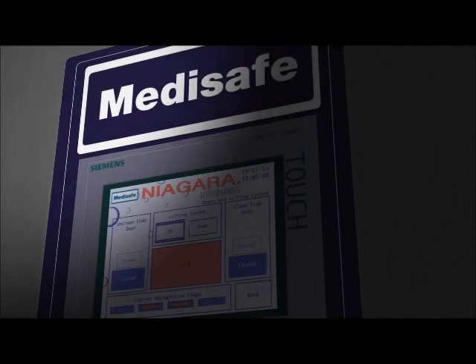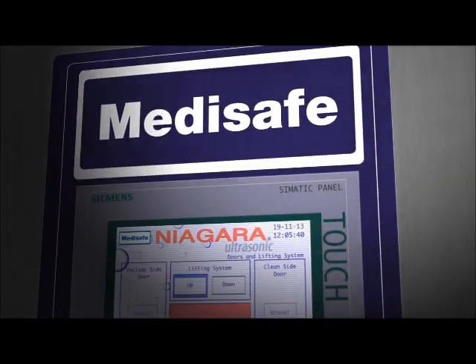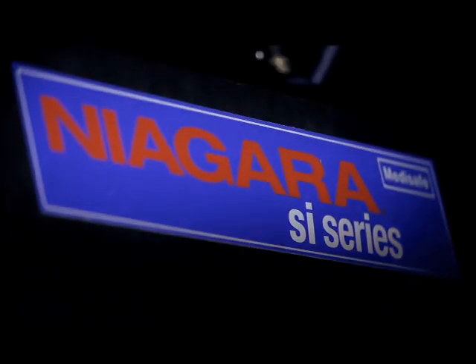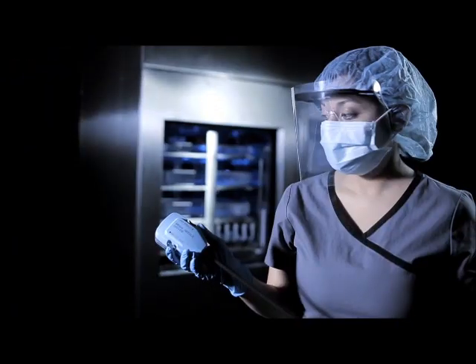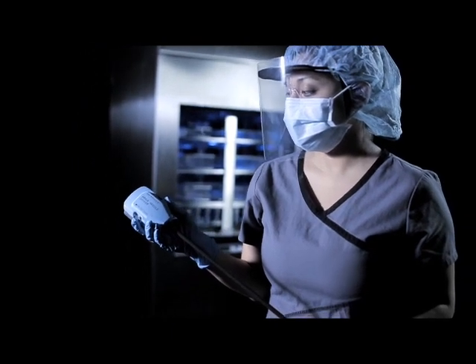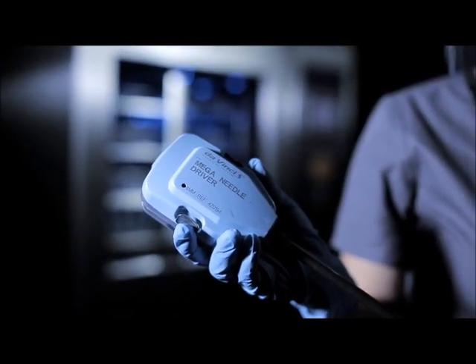When cutting-edge surgical technologies require revolutionary cleaning and disinfection, innovation is born. Introducing the next generation of pass-through washer disinfector systems: the MediSafe SI Niagara, the first in class DaVinci validated pass-through washer disinfector system with three-in-one cleaning technology, expertly designed.